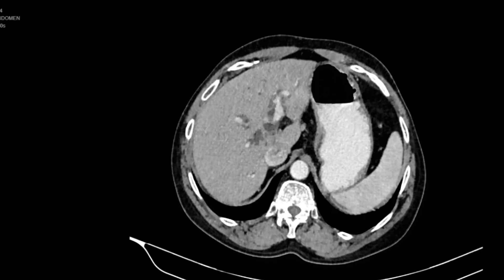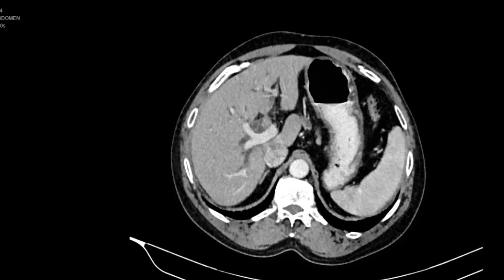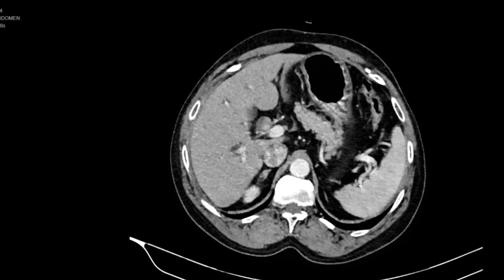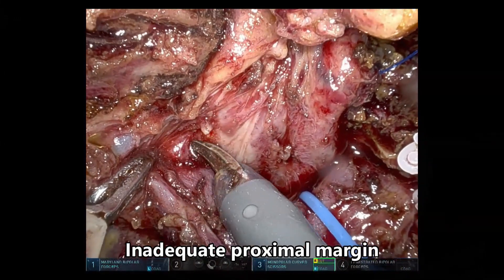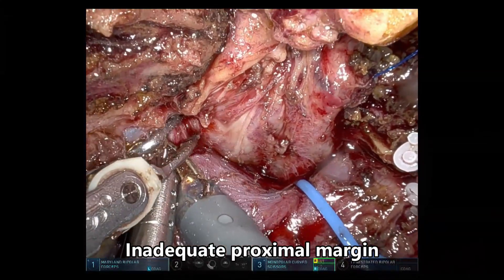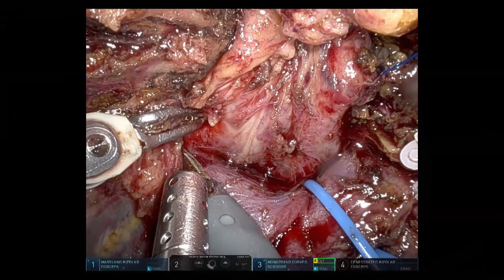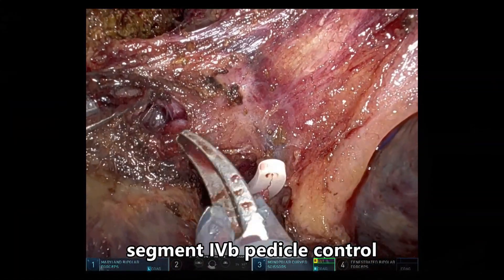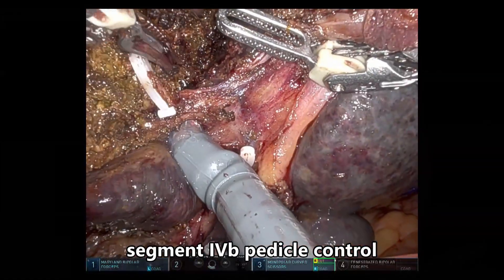This is again a patient with intraductal papillary neoplasm, but in this case, the tumor is involving the sectoral bile ducts as well. We can observe that we are not getting an adequate proximal margin without liver resection. Hence, a decision was taken to perform segment 4 liver resection. The segment 4 pedicle is ligated and divided.